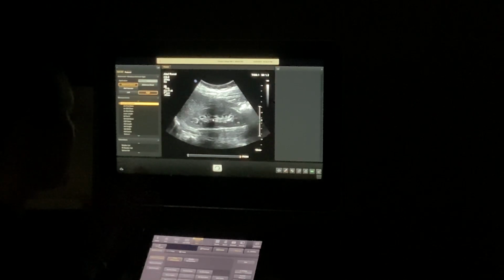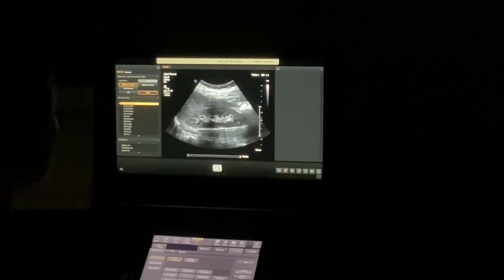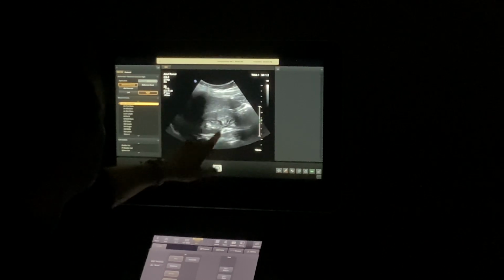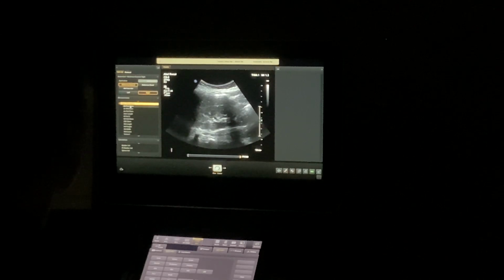Okay. There's a lot of different variants in the kidneys that are gonna make that look thicker in that mid portion, so you're gonna get the more accurate measurement when you take it on either edge of the poles there, okay? Another thing is you've got all these pyramids in here too. So all of that anechoic part is blood vessels and collecting system. So if you get a pyramid, like this one right here, you're not gonna measure to the pyramid, okay? See that there? Your measurement would not go from here to here because you're not including that in the cortex measurement. You would go here to here, just the edge of that pyramid. Does everybody see that? Okay, that's cortex measurement.